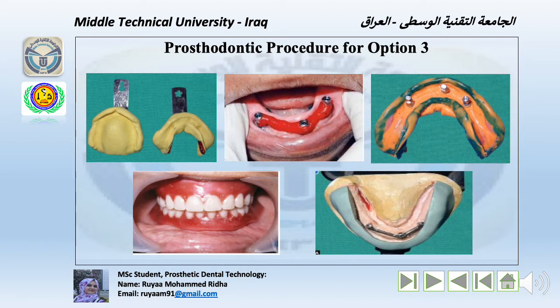On the other hand, fabricate the occlusal silicone tooth position index, incorporating the incisal edge and the occlusal half of the mandibular denture teeth. Then the occlusal silicone index is cut exactly in the center, joining the incisal edge and the central grooves of the molars.